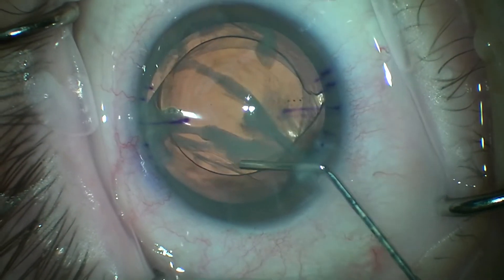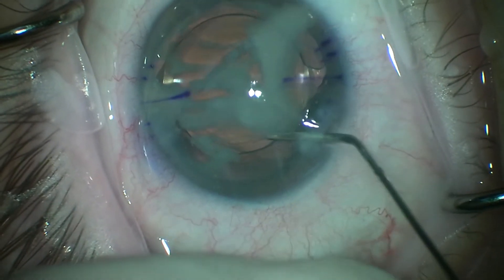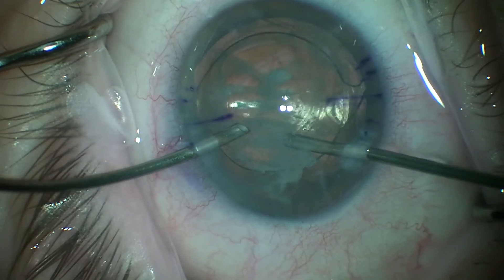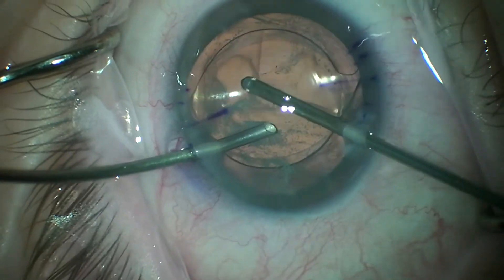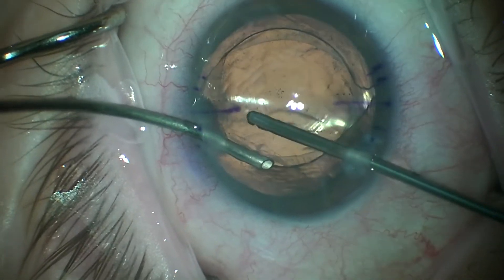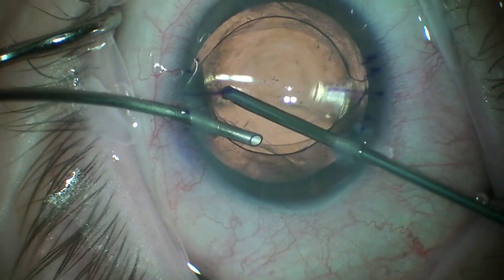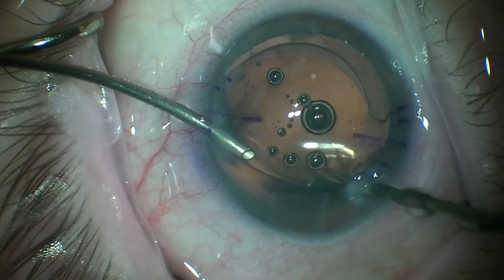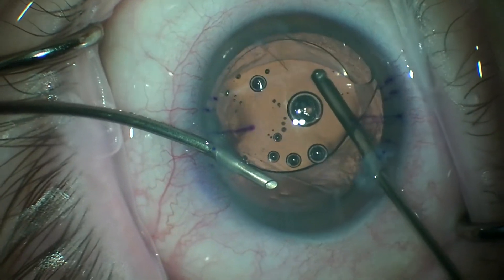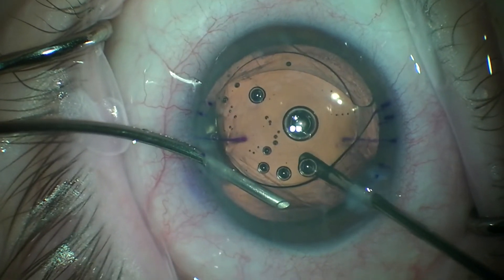There's viscoelastic in the eye and it's a little hard to stain vitreous with all that viscoelastic, but I'm trying anyway. The way it jets through the viscoelastic almost looks like there is vitreous, but I turned the infusion on and it's not really vitreous — it's just triamcinolone particles suspended in viscoelastic. Whether I never got any vitreous in the anterior chamber, or whether I vitrectomized it all before putting the triamcinolone in, I can't say for certain. The end result is we want to leave a clean eye and not have vitreous herniated around the edge of the optic with traction on it.